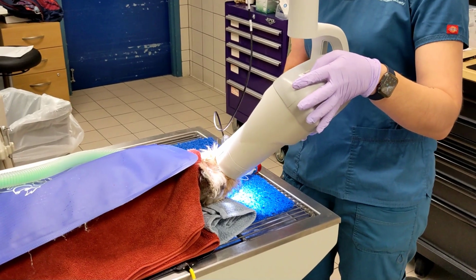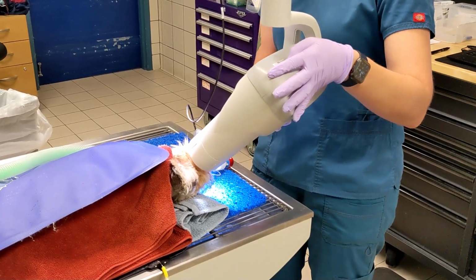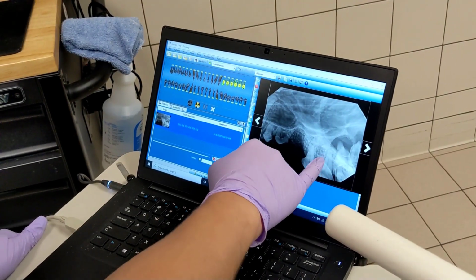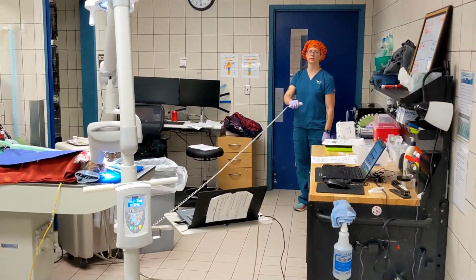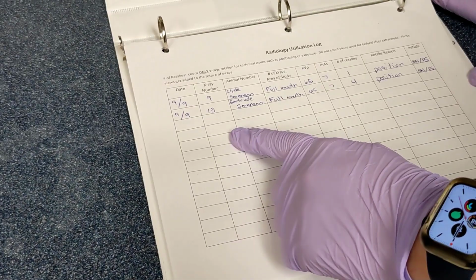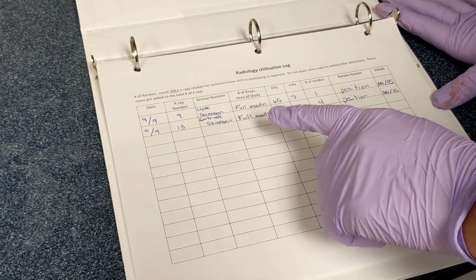Animal Humane Society utilizes portable Progeny Radiograph machines to take X-ray images to aid in dental procedures. In this video, you will learn how to set up these machines, take the images, and log the number of radiographic images taken during each session.